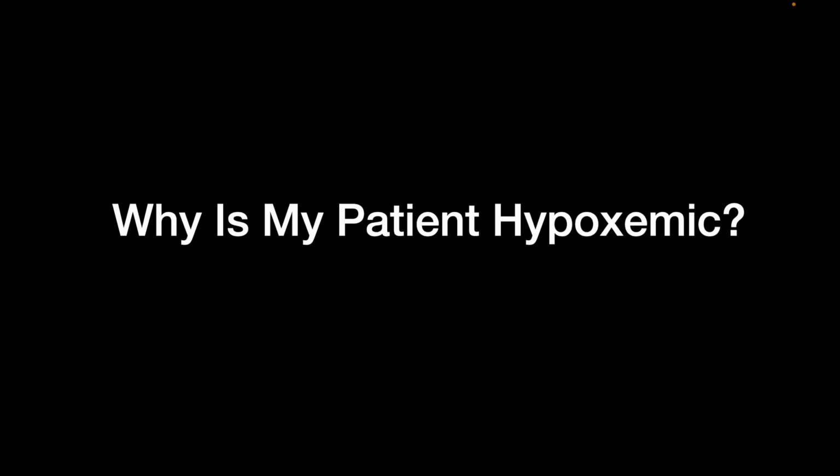The next important thing that we get in our emergencies and ICUs is the patient who is hypoxemic, where I don't have much of a history and I need something to image, and chest X-ray is going to take its time, so I need something to work with.